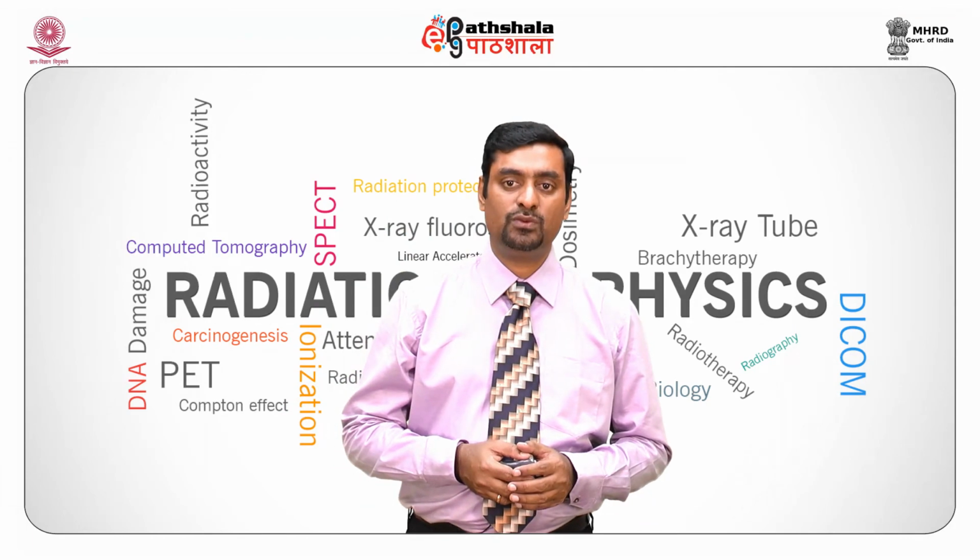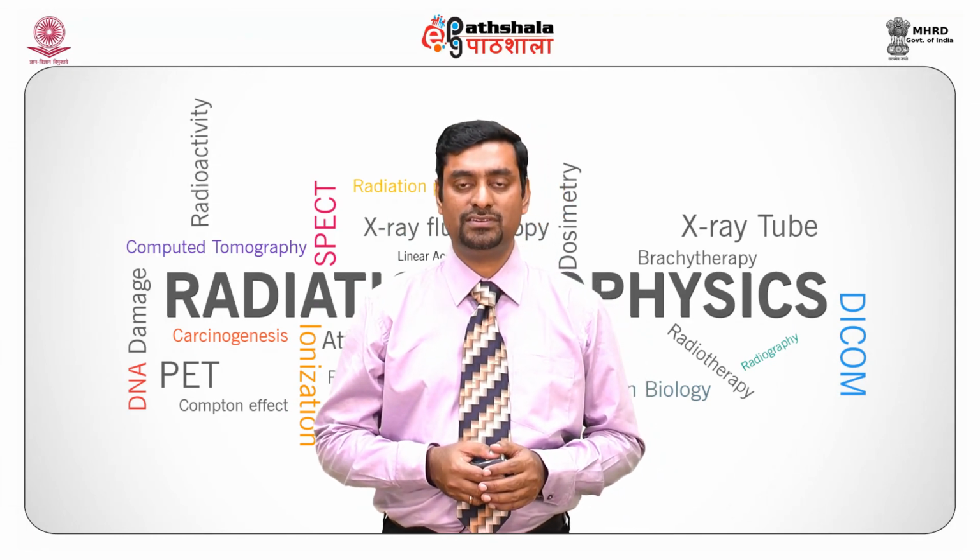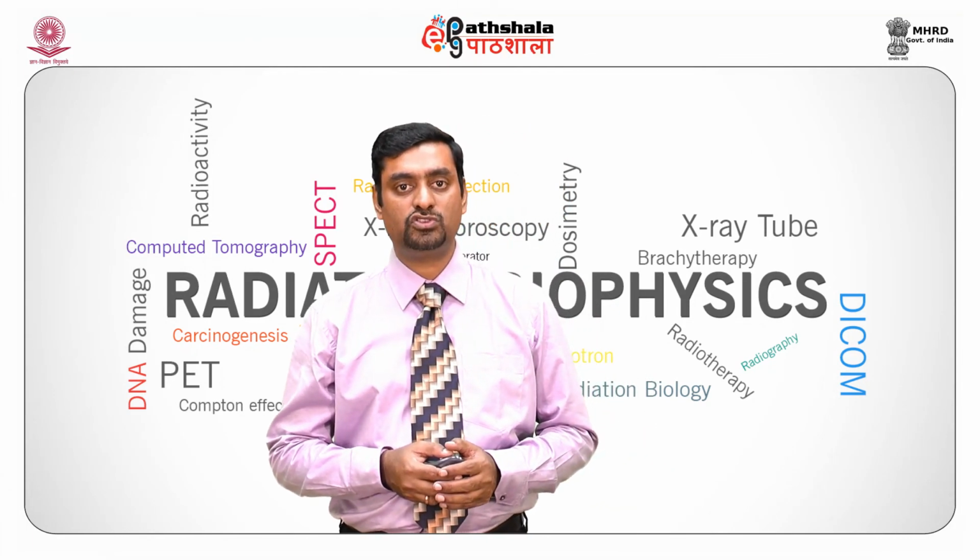Adequate care should be taken while working with fluoroscopic devices, as it involves high radiation dose to patients and staff.